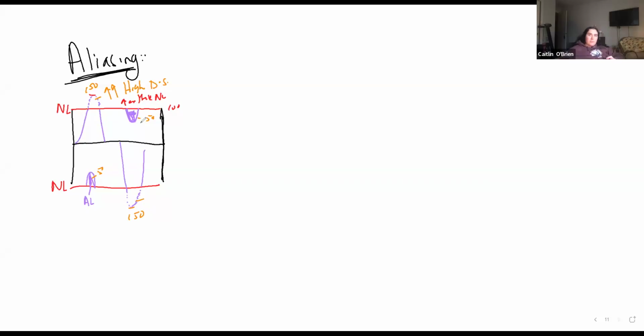Yes. But that aliasing, in contrast to your flow reversal, which would have been here or here, is going to be against your extreme. And that's what we mainly said when we did our color map.